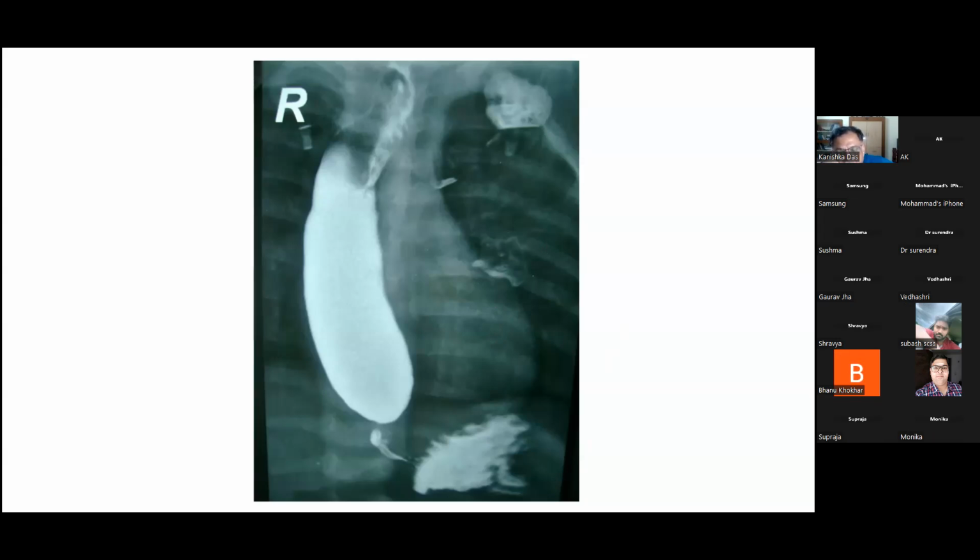Okay, so you think this is achalasia, right? Yes, sir. Why is this not a lower esophageal stricture? So the characteristic dilatation along with beaking is suggestive of achalasia cardia. A stricture would have something like an apple core appearance, wherein we can see the shouldering.